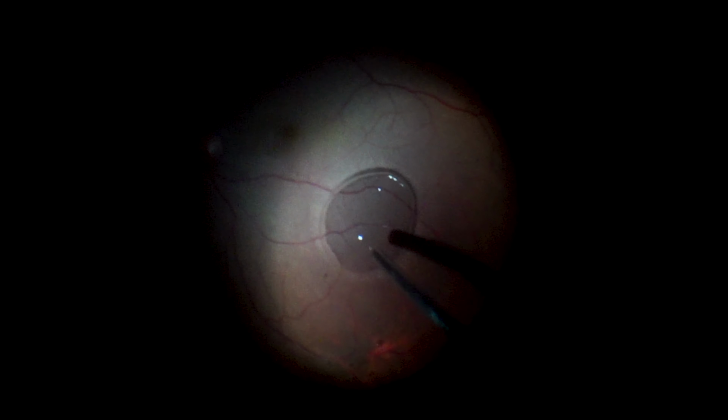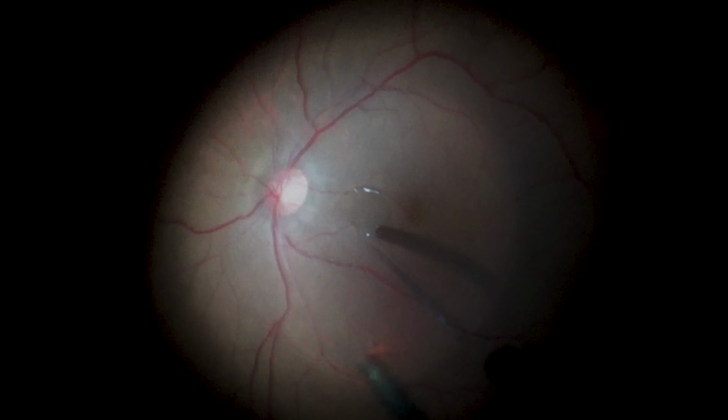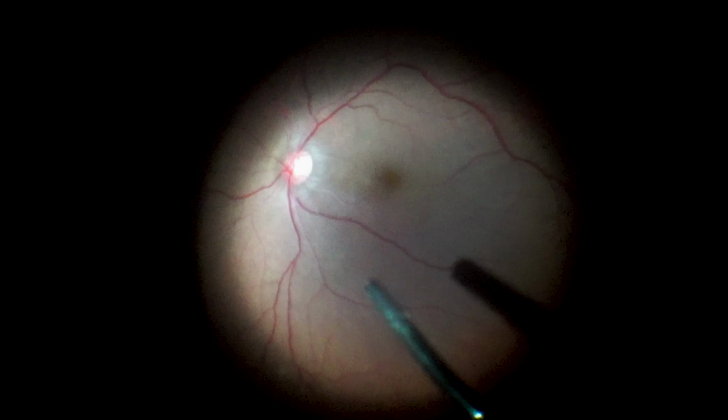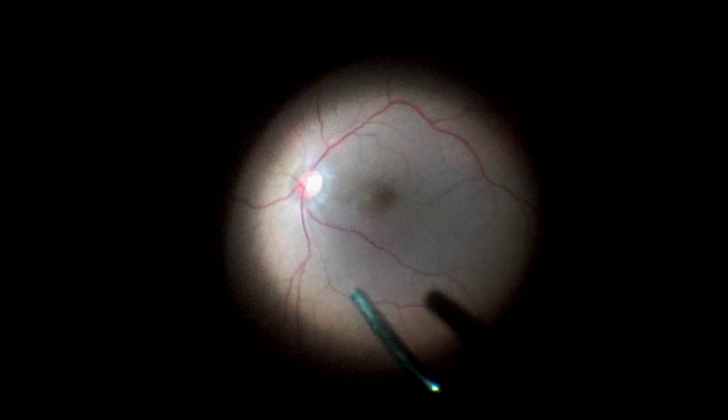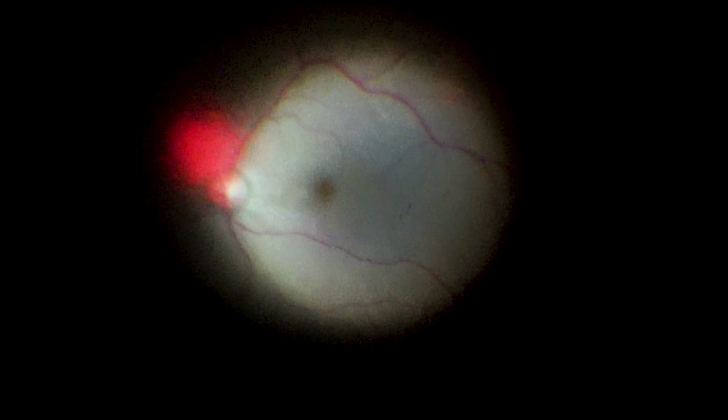A white without pressure-like line was found at the superior temporal periphery. At this point, we had removed all PFO. We realized that there was a retinal detachment at the whitish area, probably due to chronic and repeated contact of the lens with the retinal surface. A decision was about to be made on whether or not to do a retinotomy.